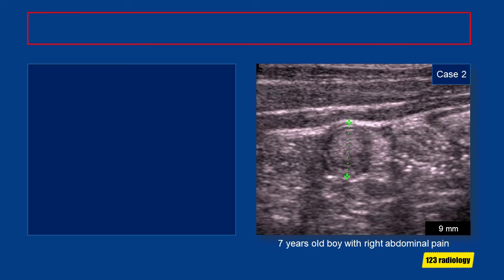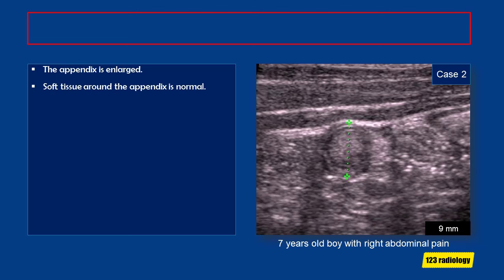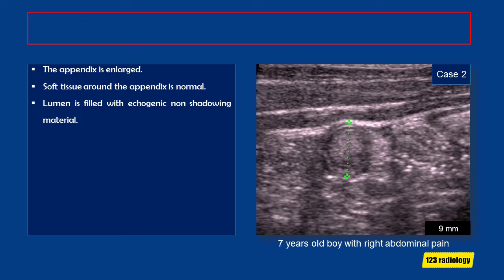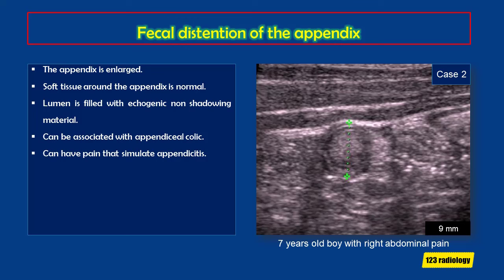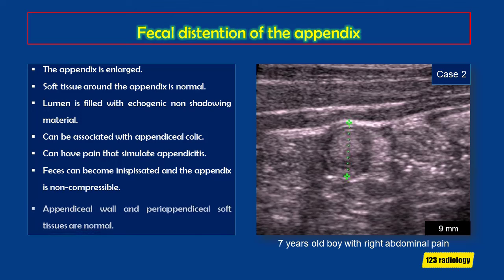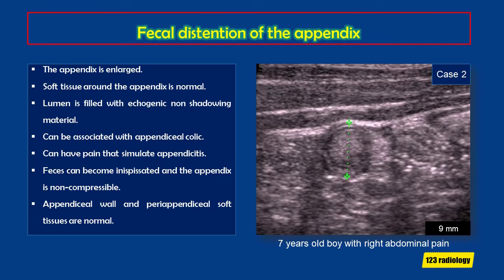Another case: a 7-year-old boy with right abdominal pain. The appendix measures about 9 mm in diameter, but the wall appears normal in thickness and the peri-appendiceal soft tissues look normal. The lumen is filled with echogenic non-shadowing material — this is fecal distension of the appendix. These cases can be associated with appendiceal colic, mimicking appendicitis. The appendix can get as large as 1 cm in diameter; the feces can become inspissated and the appendix is non-compressible, but the appendiceal wall and peri-appendiceal soft tissues remain normal.